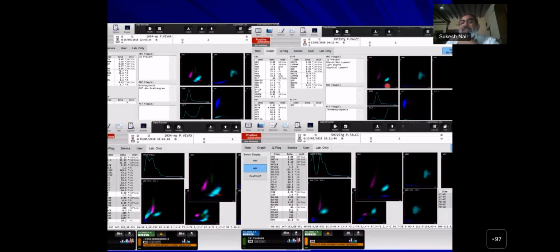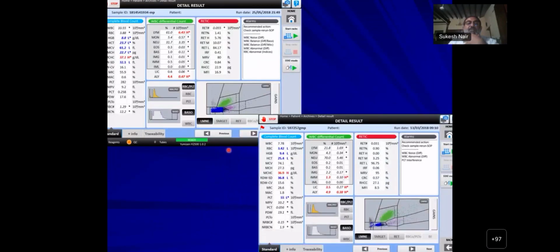While here you can see that there are many cells which are being counted as eosinophils, but they're under the neutrophils. They do not have the scatter of eosinophils, but because they're on the gate of lower fluorescence, they're being counted as eosinophils. But if you see the other angle, you can see that population here, which has nothing to do with eosinophils or neutrophils. That is pseudoeosinophilia, which can happen in falciparum. And of course, you have pseudolymphocytosis in Horiba or Humacount.